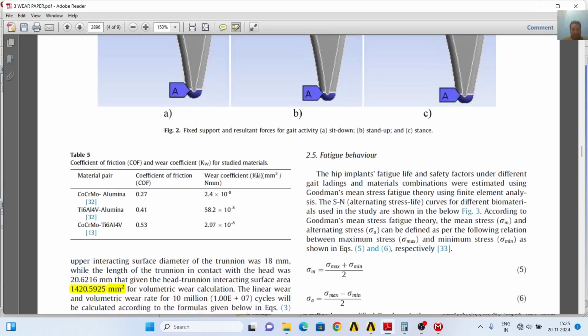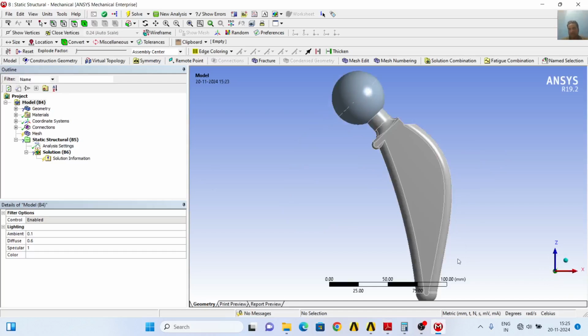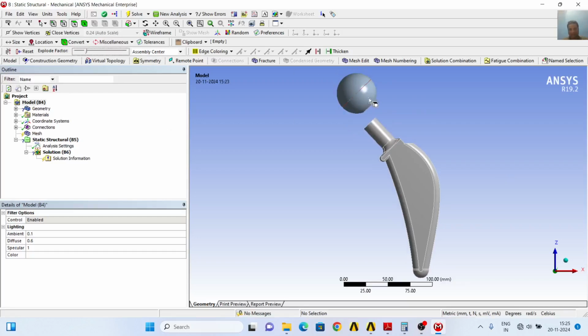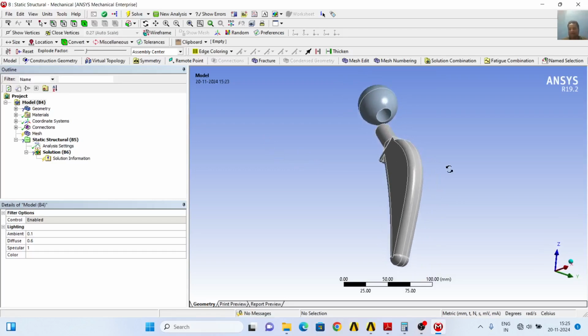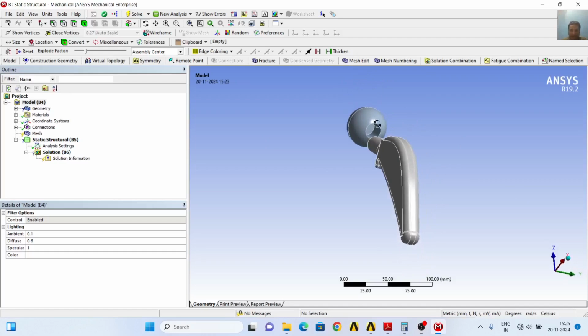So initially we need to know KW, which we will multiply by the contact pressure and sliding distance, which we will get from the analysis. We will go into the Ansys Workbench tab, and you can see that this is the geometry of the hip implant, in which we will find the wear between these two parts. There are two parts: the hip implant head and the hip implant stem. We will calculate the wear between the neck of the stem and the hole of the head.